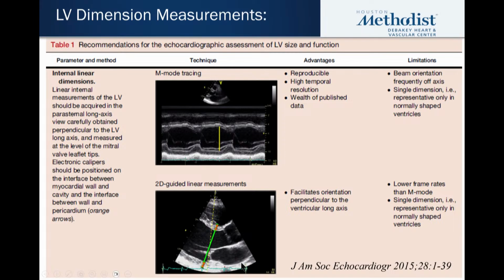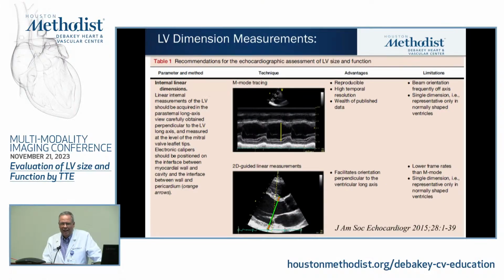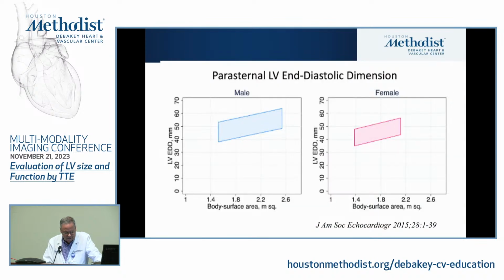simple formula that was published about 100 years ago. I don't think Dr. Sabi was even a fellow when that formula came out. We're not going to talk about that formula today. It does have a few sources of error, but it's what is used most of the time these days.